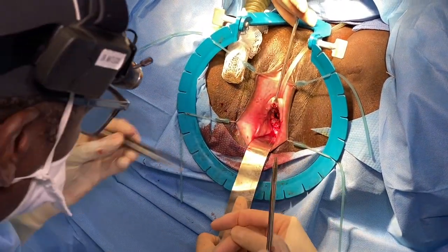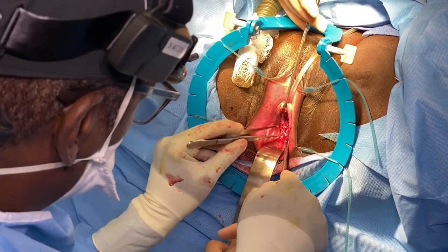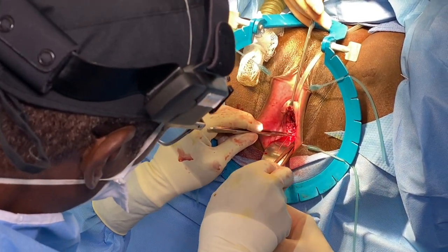Now we're closing it. This is an absorbable suture. The patient will be completely healed in 6 weeks. No sex for 6 weeks. No exercise for 6 weeks. No yoga, spinning, cycling, Pilates for 6 weeks. Go back to work in a week.